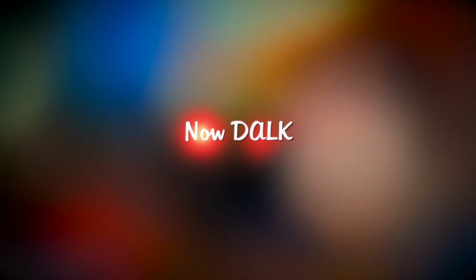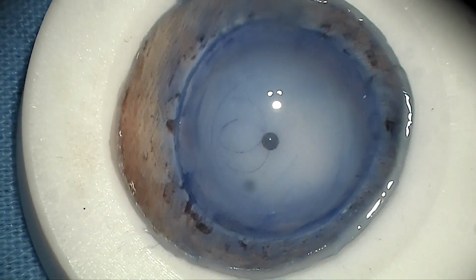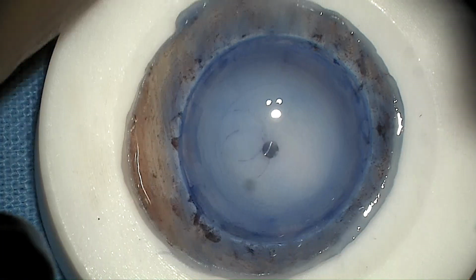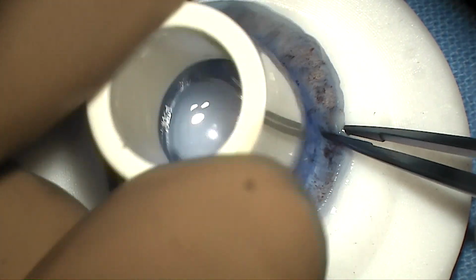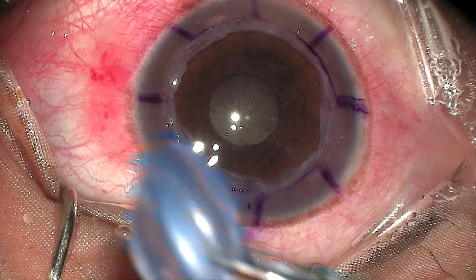The remaining anterior part of the donor tissue is then kept back in the preservative media, which is now ready for donor preparation in DALK surgery of 8 to 8.5 mm graft. Since the faint 9.5 mm mark from the initial partial trephination is already there, harvesting up to a 9.5 mm DALK graft is possible, and there is no need to do Descemet endothelial removal in this case.